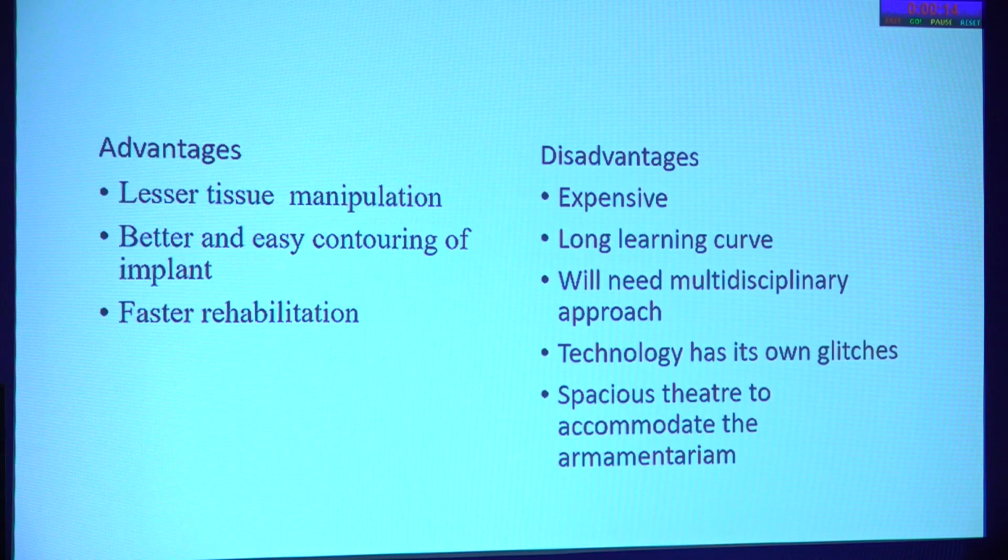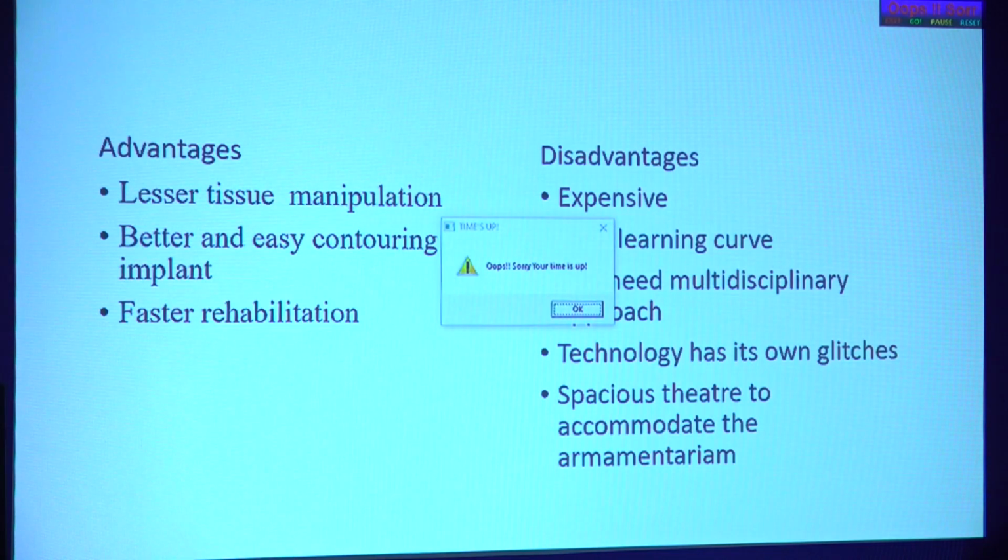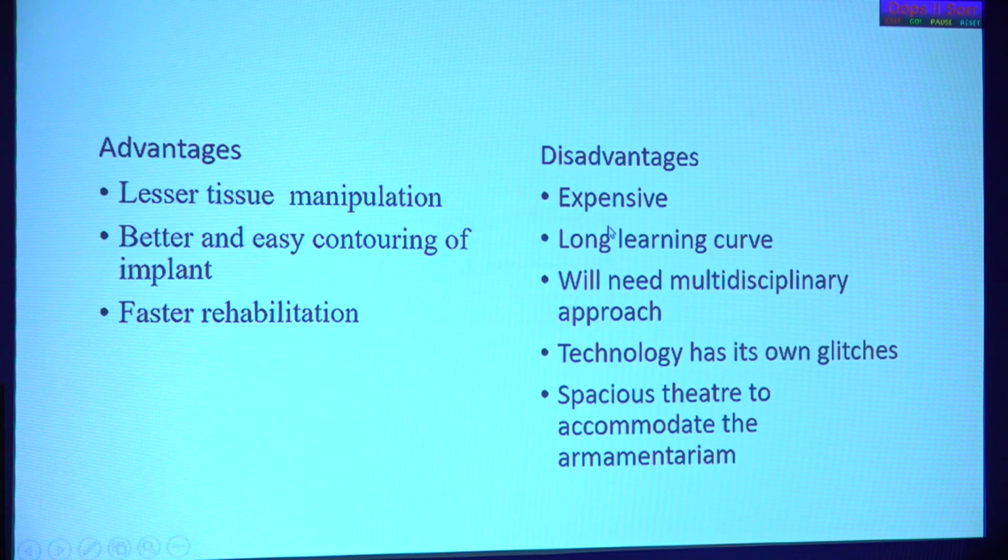The advantages are lesser tissue manipulation, better and easier contouring of the implant, and definitely faster rehabilitation. But the disadvantage is that it is very expensive. It equals the cost of a femto machine, I guess. So when we think about returns, we might not be able to get it in a single specialty center. It has a long learning curve and needs a multidisciplinary approach. It needs a spacious theater to accommodate the armamentarium.